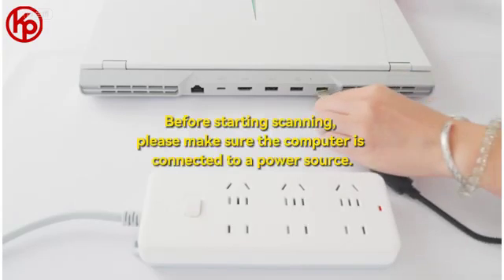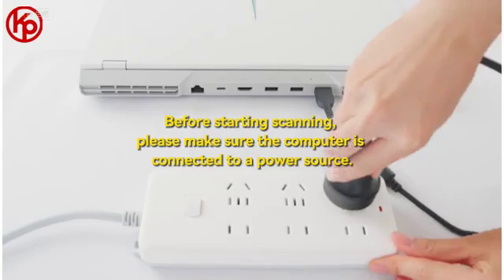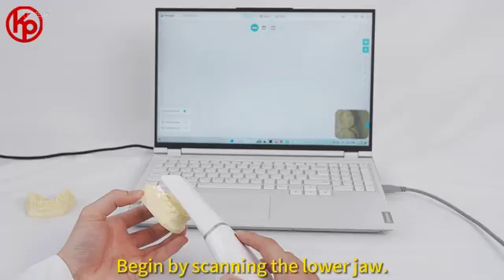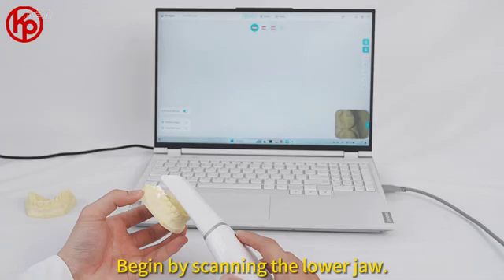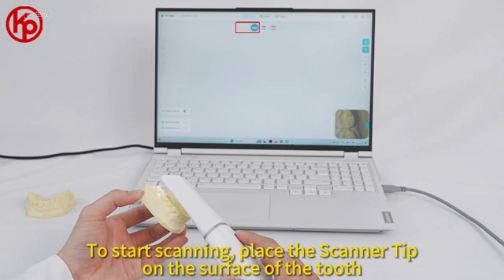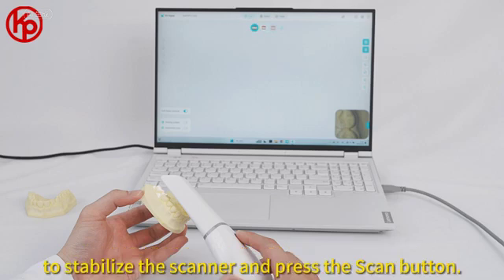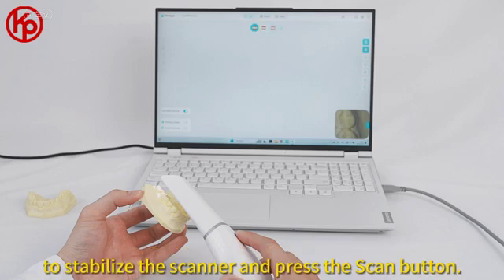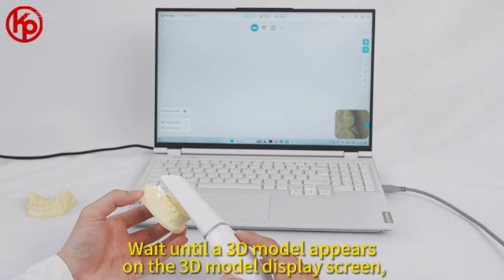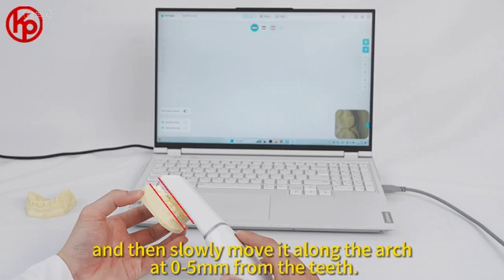Before starting scanning, please make sure the computer is connected to a power source. Begin by scanning the lower jaw. To start scanning, place the scanner tip on the surface of the tooth to stabilize the scanner and press the scan button. Wait until a 3D model appears on the 3D model display screen, and then slowly move it along the arch.